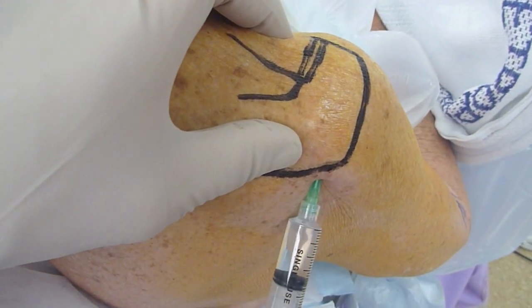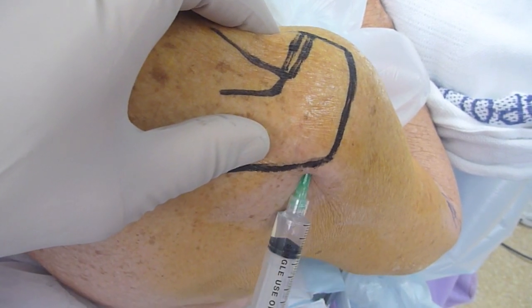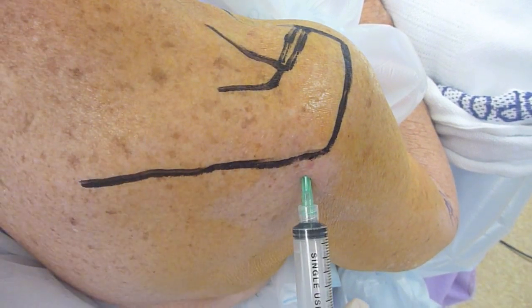I use just one ampoule of steroid — you could use more, but I think one ampoule is usually enough. I find patients tolerate this injection very well and are usually very happy with the results.